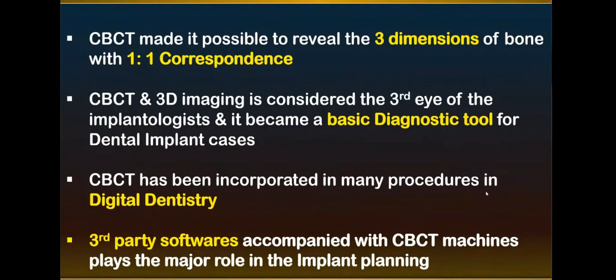The CBCT as a machine is like a capture or acquisition equipment. Also integrated with the CBCT is third-party software. The third-party software is the one that we use to display and manipulate the images and make our treatment planning.